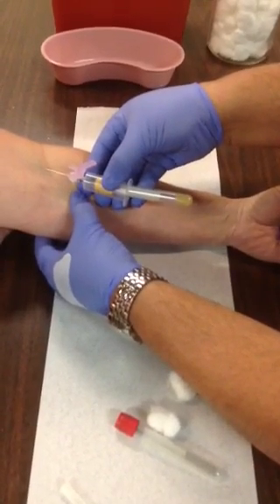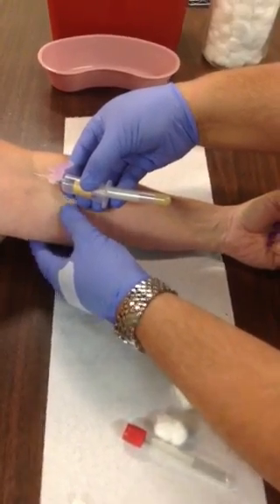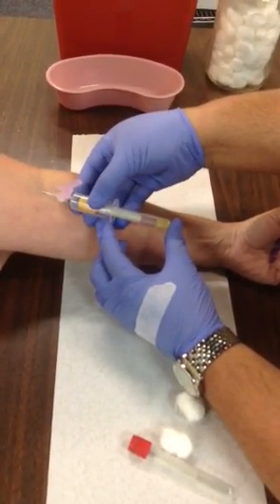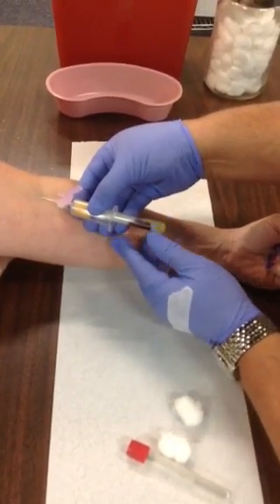Warn the patient: you're going to feel a stick in one, two, and three — then just drop in. Once you're in, stop and anchor down. Notice how these fingers are anchored down to her arm. Take your thumb and index finger and pop the tube in. Notice how you're pushing the tube but holding that flange with the other hand.